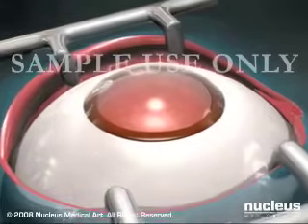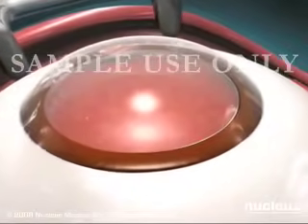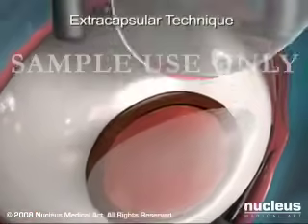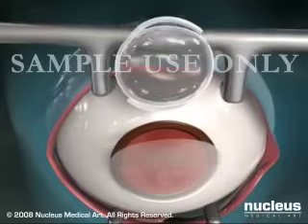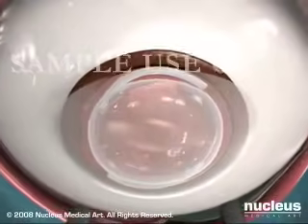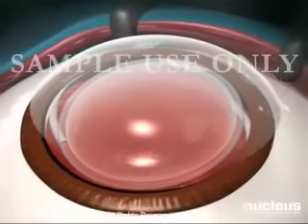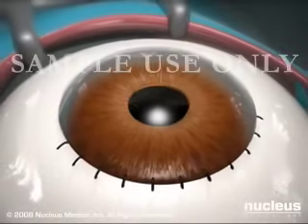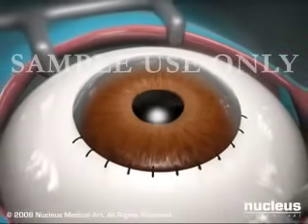Another method for removing cataracts is called the extracapsular technique. In this procedure, the incision made near the cornea is large enough to remove the cataract in one piece. Again, an artificial lens is inserted to replace the natural lens. Recovery from this type of cataract surgery is usually slower. Because the incision is larger, this procedure does require stitches. However, the stitches rarely need to be removed.